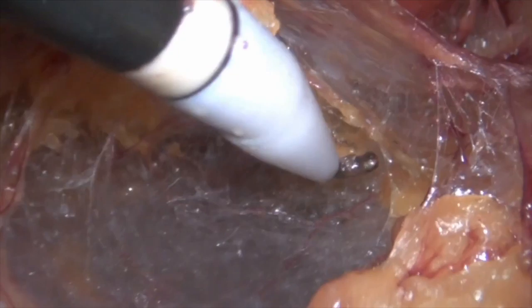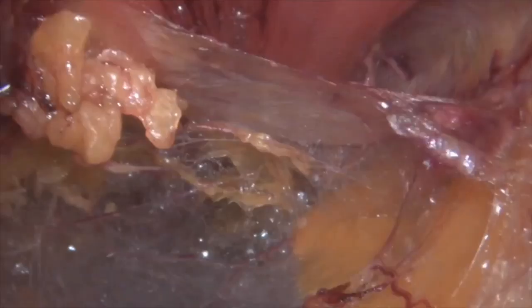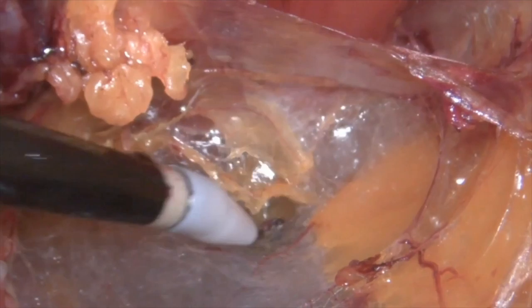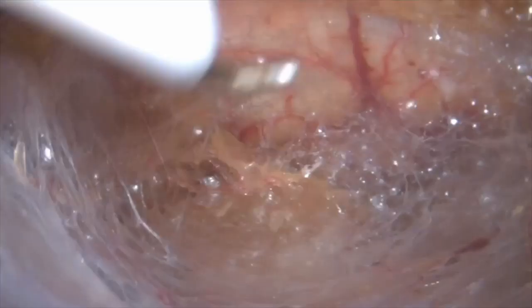This is a drawback of the telescope. You can see just above my instrument, there is a fascia, and above the fascia, the telescope had gone. So that is the wrong plane. So this is the one layer of transversalis fascia which I pushed with my hook, and the other layer is below my hook, and we are dissecting between the two layers, and you can see how avascular it is, and just a blunt dissection is enough to open up the space.